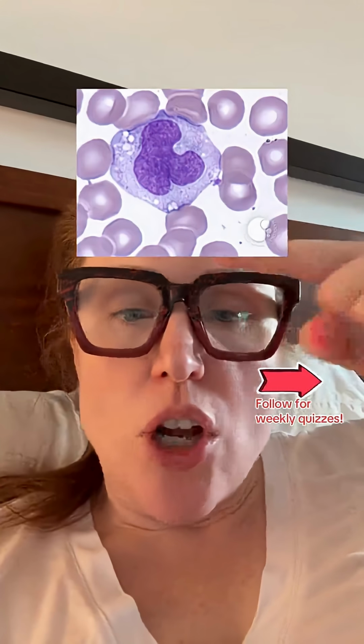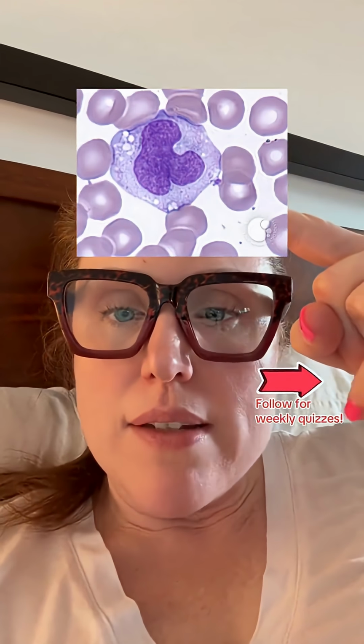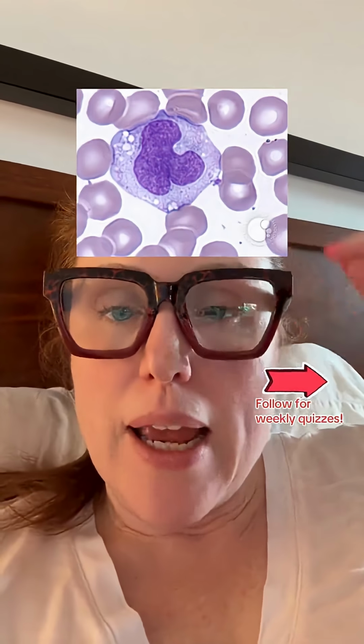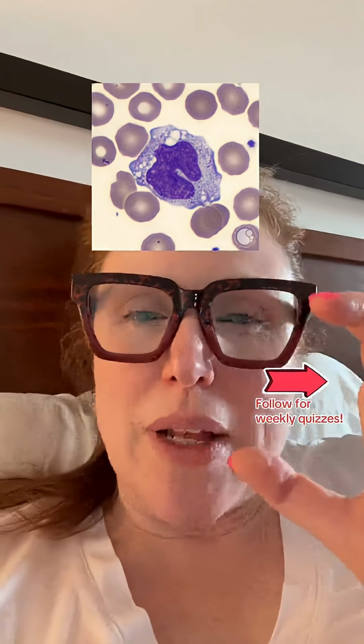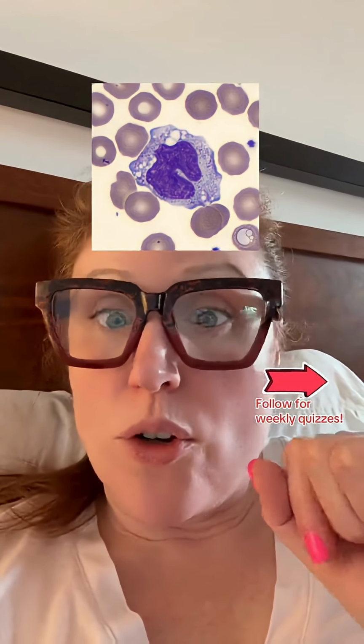This cell is much larger than the surrounding red blood cells. It has an irregular shape and it has an irregularly shaped nucleus. The next thing I look for is what is the ratio of the nucleus to cytoplasm. That will help you identify a lot of different types of cells. So in this case, the nucleus to cytoplasm ratio is maybe 2:1 or 3:1.